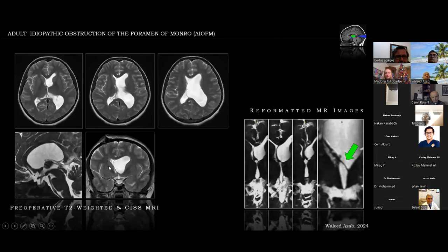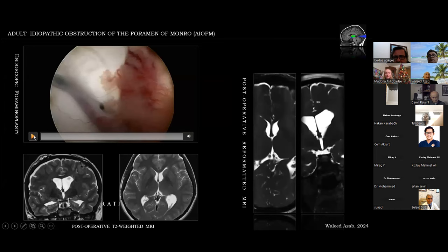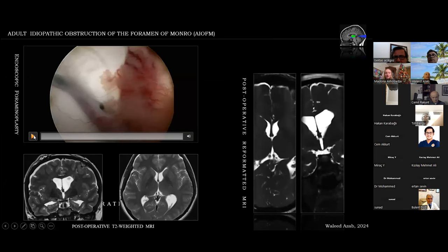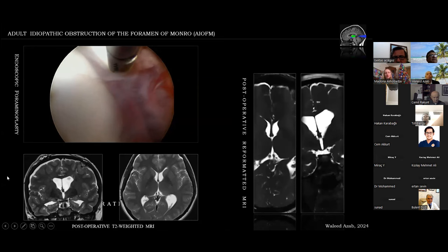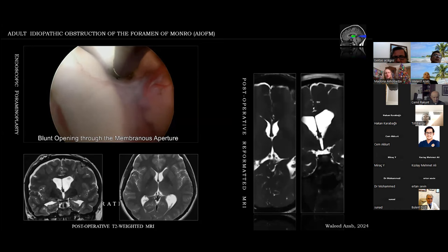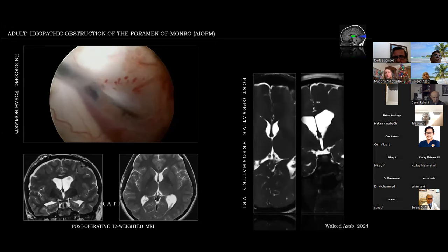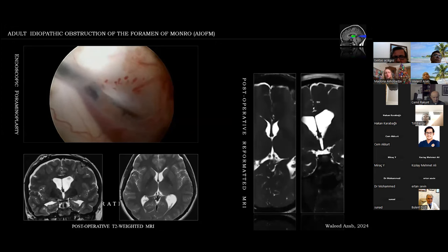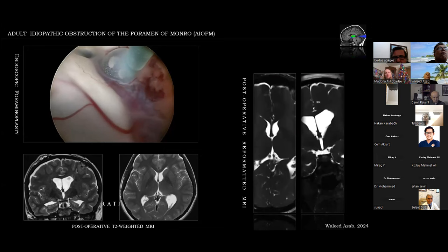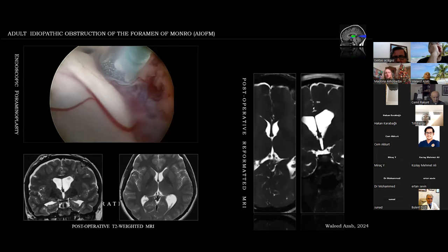Reformatted MR imaging revealed a membranous structure occluding the foramen of Monro on the left side. We performed an endoscopic foramenoplasty. Here is the initial view at the region of the foramen of Monro in the left lateral ventricle — the choroid plexus is visible and the foramen of Monro shows just a very small opening when the ventricle was entered. A blunt forceps was introduced into the small aperture of the membrane, then a Fogarty catheter was used for enlargement of the balloon, enlarging the membrane.